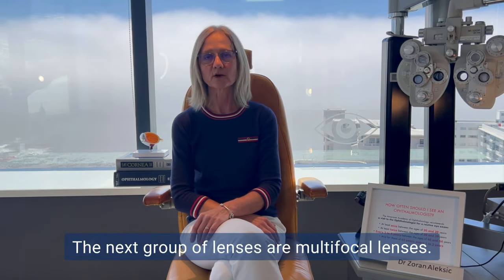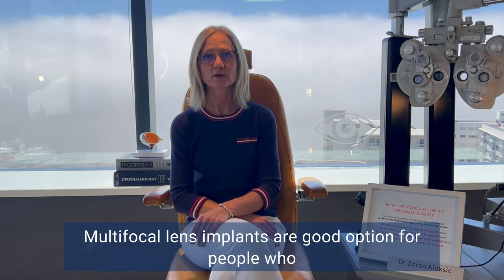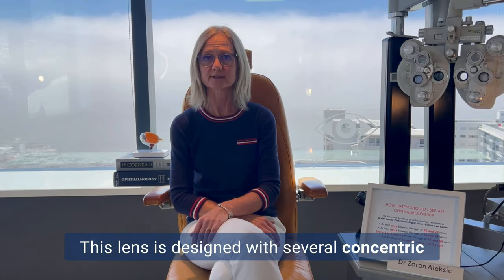A group of lenses are multifocal lenses. Multifocal lens implants are a good option for people who want to be less dependent on glasses altogether, for those who do not like wearing reading glasses.